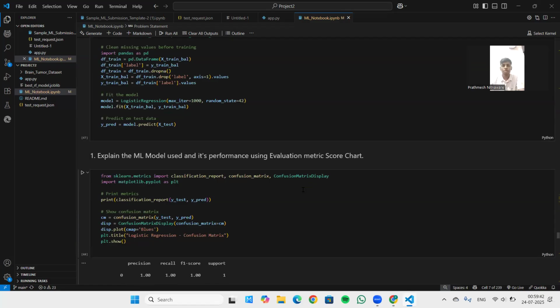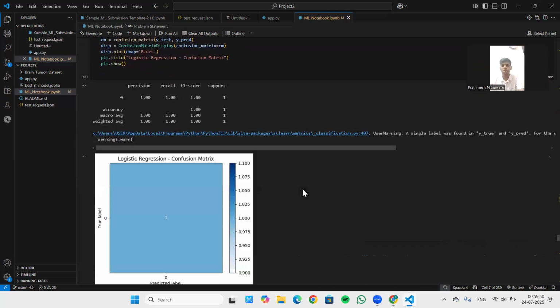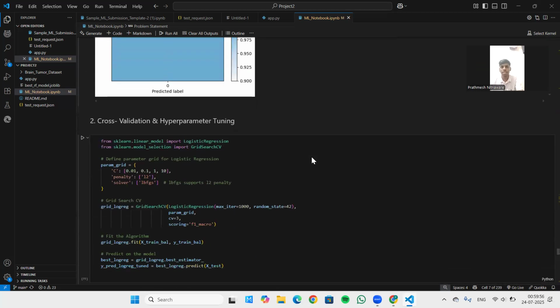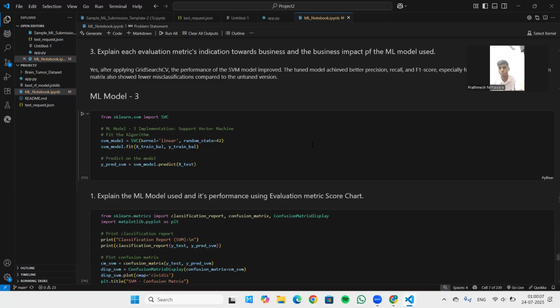Random forest performed the best, with around 92% accuracy and a high F1 score, so I selected it as the final model. Once I had the final model, I saved it using joblib, and I also saved the SVD transform to ensure consistency between the training and the real-time prediction. This made it easy to load the model back later and predict on new, unseen data.